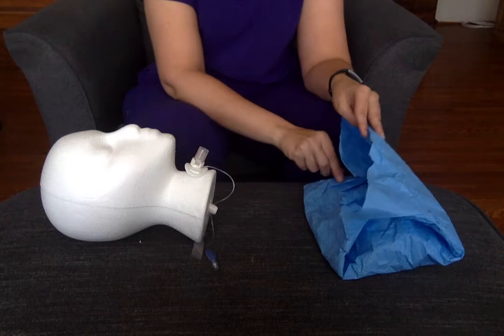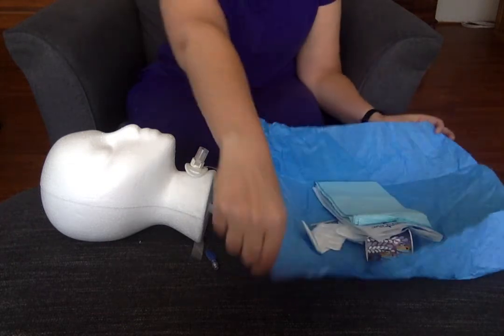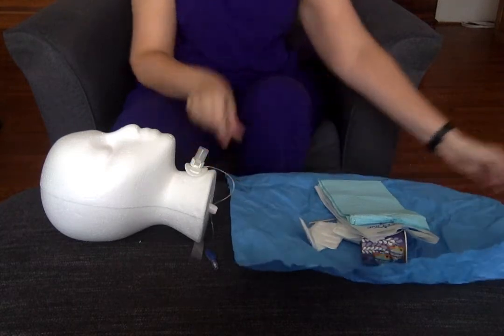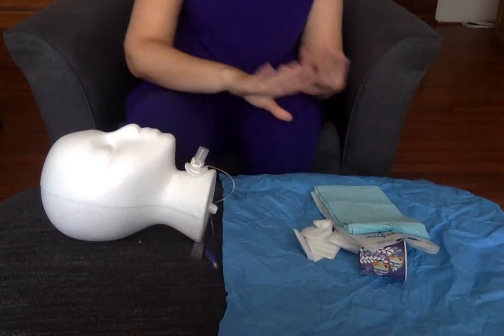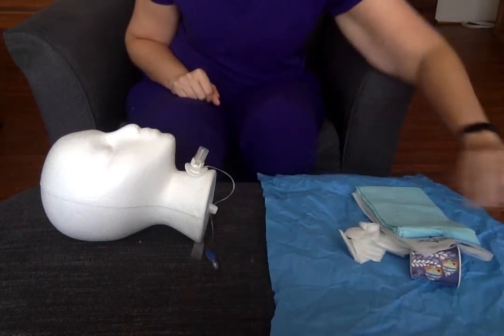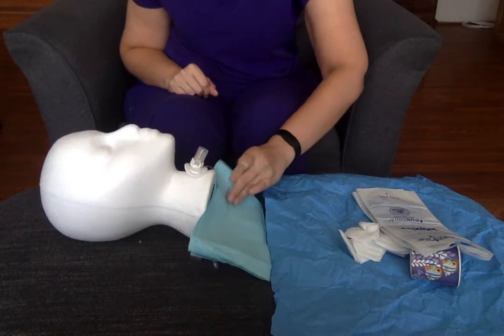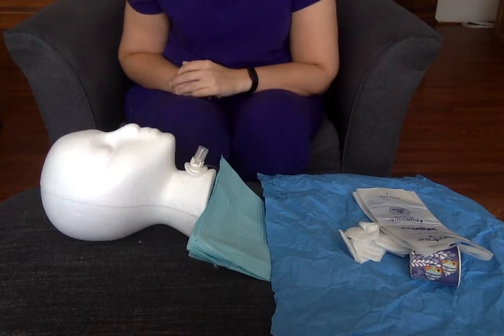I'm going to go ahead and open my sterile kit. Inside it looks similar to what you would see in yours, but I can pull out my drape carefully without touching anything. I can drape my patient to make sure I don't get sputum on them.